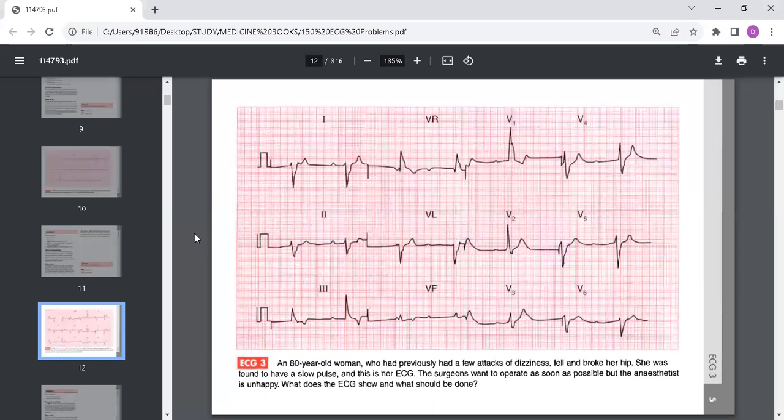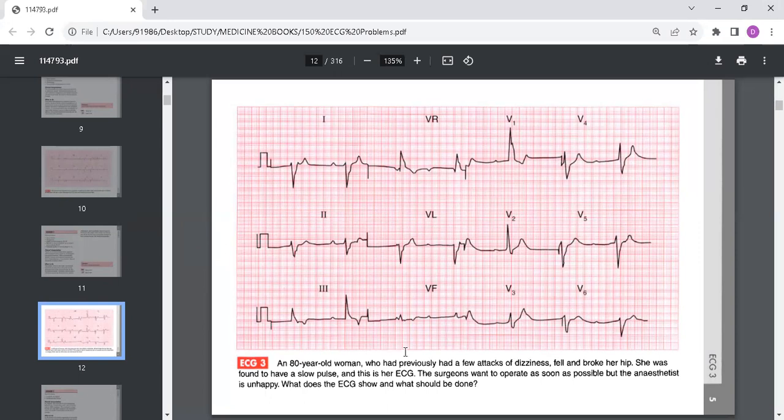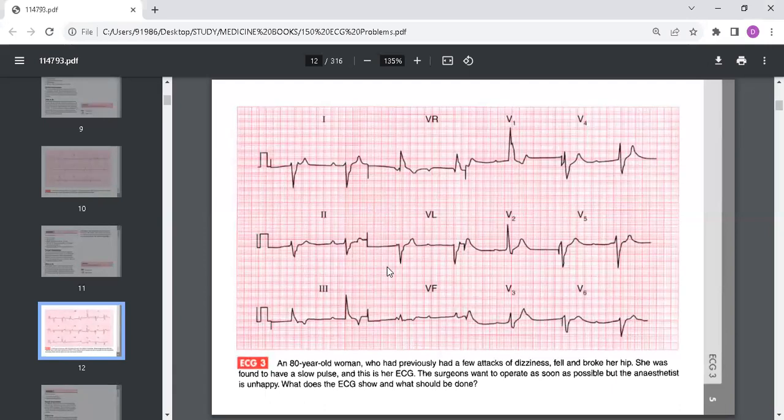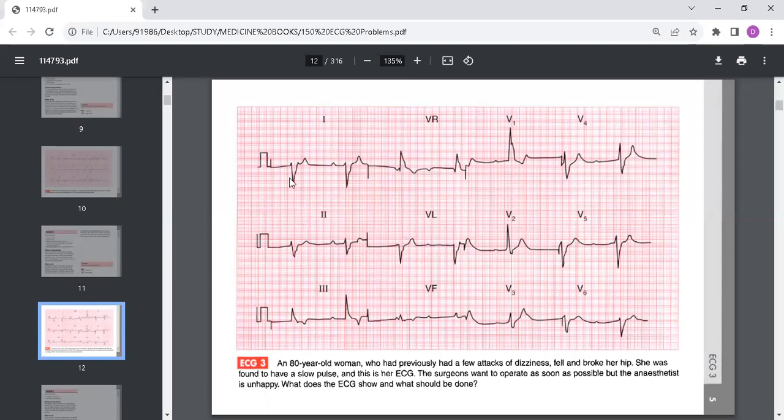This is an ECG of an 80-year-old woman who had previously had a few attacks of dizziness, fell and broke her hip. She was found to have a slow pulse and this is her ECG. The surgeons want to operate as soon as possible but the anesthetist is unhappy. What does the ECG show and what should be done?